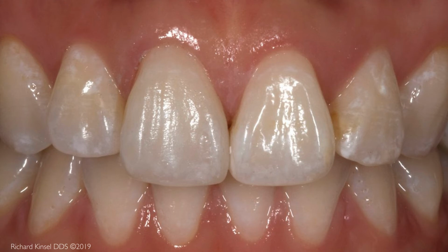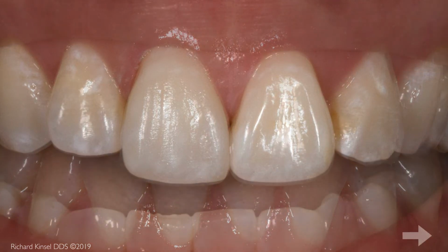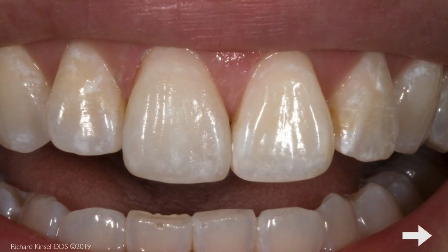The porcelain veneer establishes the proper length and prominence of the natural incisor tooth. The internal colors and translucencies are harmonious with the surrounding teeth.